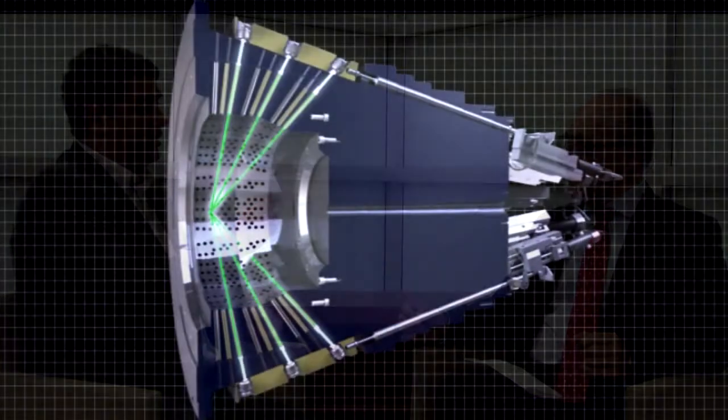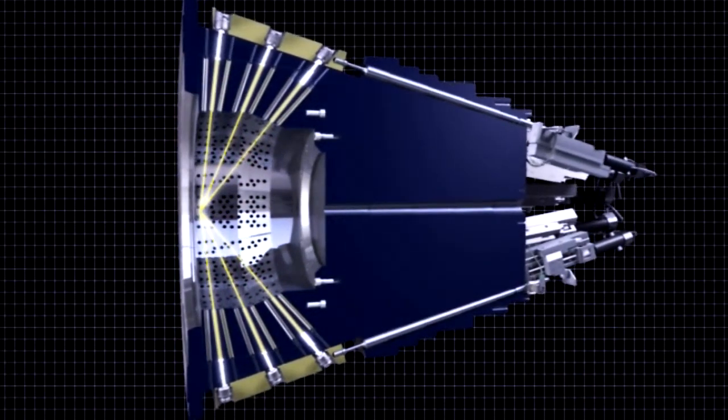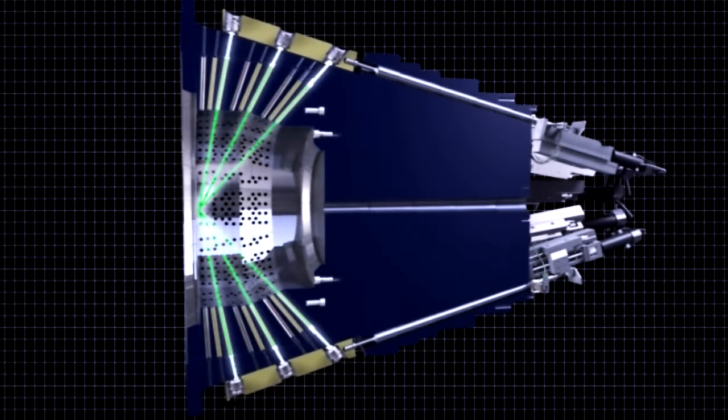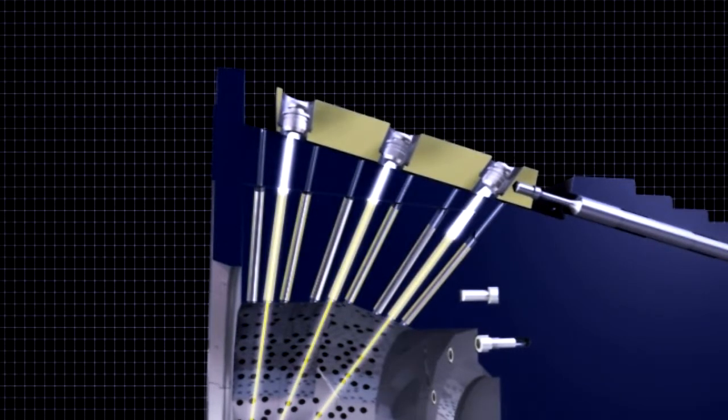Although it's called a gamma knife, it's actually not a physical knife. It's a series of 192 beams all focused down to one point, highly focused, and it's got the precision of a knife. It's actually sub-millimetre precision, developed by a neurosurgeon historically, and used as a gamma knife, like a surgical tool, can be wielded like a knife.